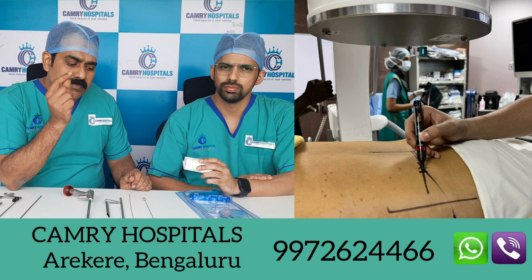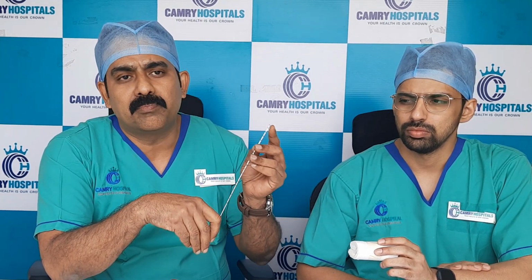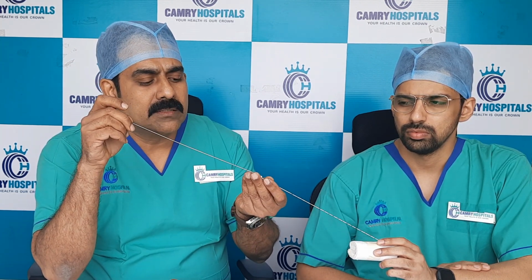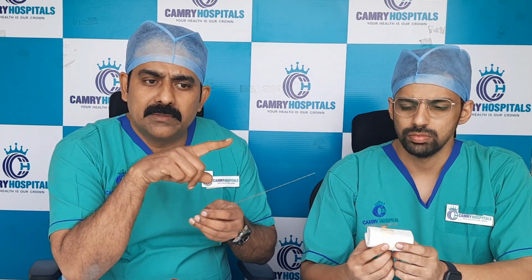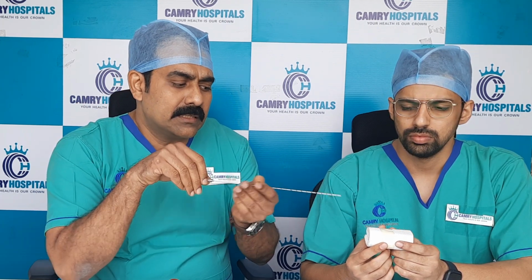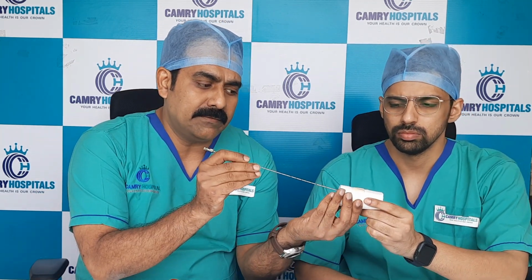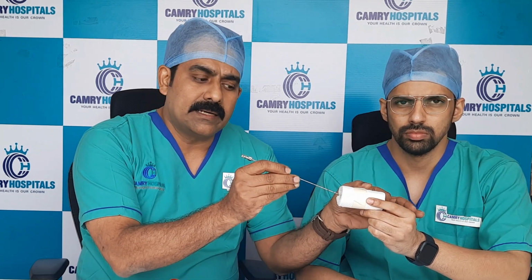Then we will have a small needle. The needle diameter is 1.2 mm, and the inner diameter is 1 mm. So it's just a small needle, so there is no tissue damage. We are not cutting any bones, we are not violating any tissues. Under local anesthesia we will just put this needle into the skin, and it enters the disc.